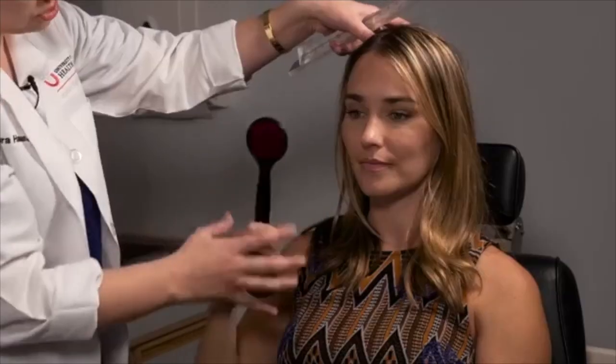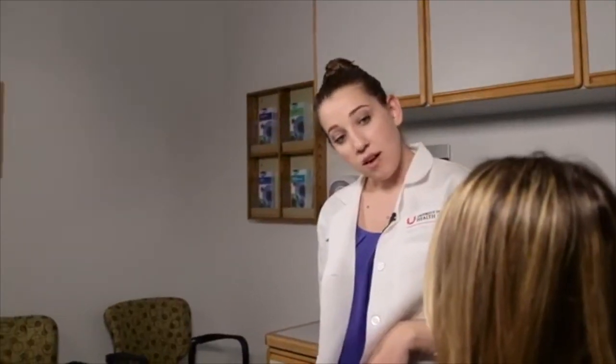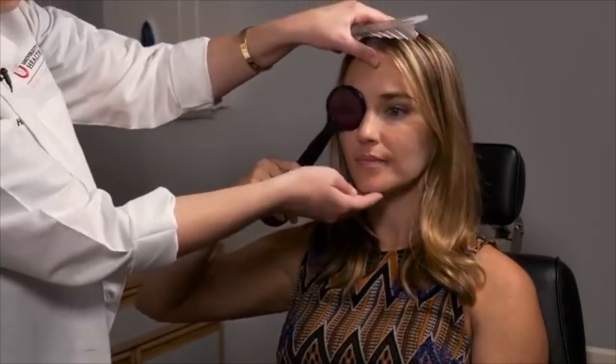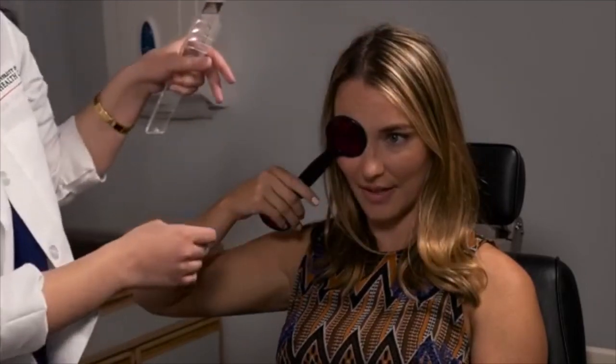So now we're going to turn. There you go. Turn your head. Good. So this is measuring her in left gaze. So go ahead and look back at the light. Is the light above or below the red line? It's right on it. So perfectly aligned there. And how about there in right gaze? Right on it. Very good. You can also do it in down gaze. Exactly on it. And up gaze. Right on it.